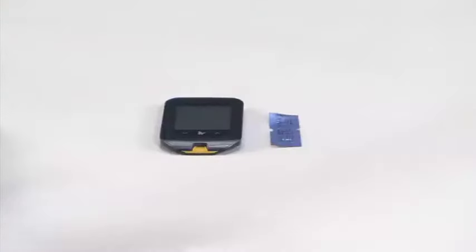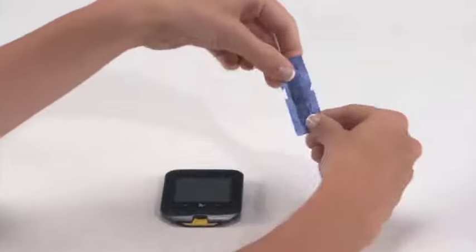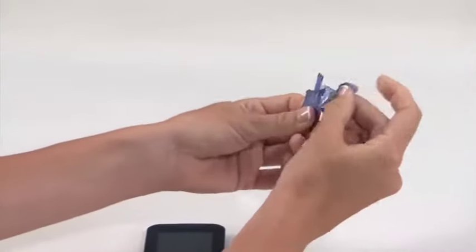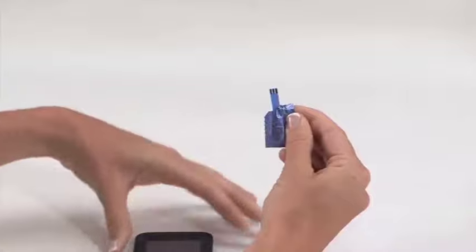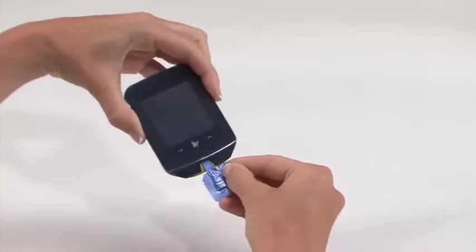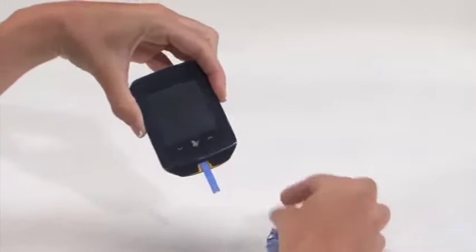Open the test strip foil at the notch and tear down to expose the test strip. Insert the test strip into the meter until it stops. This will turn the meter on.